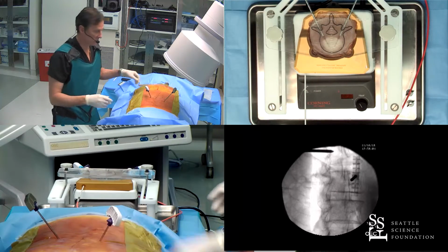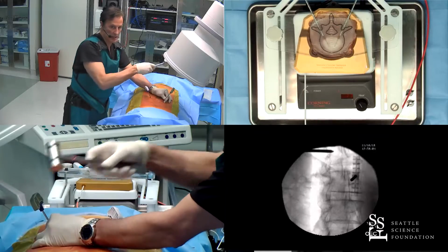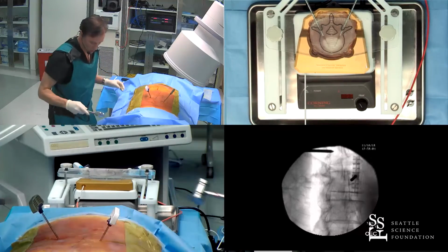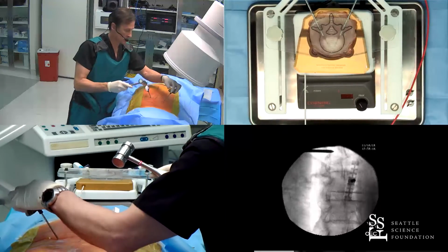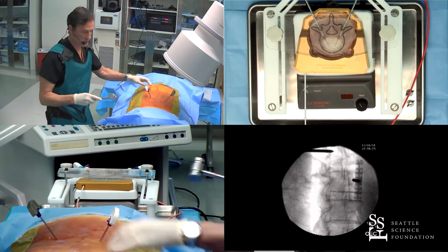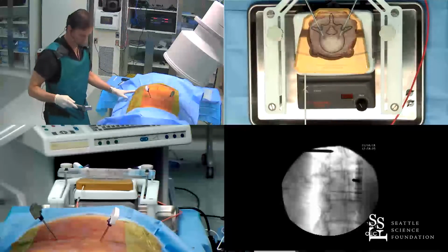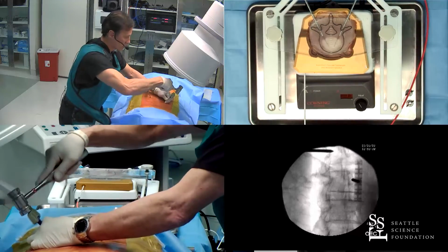So this is an en face approach. We'll just come down, this is looking straight down the barrel of the pedicle, and we just mine the medial wall, and we just keep going until we're in the posterior portion of the vertebral body, not to transgress the medial wall of the pedicle. And we will go until it feels like we're in the posterior portion of the vertebral body.